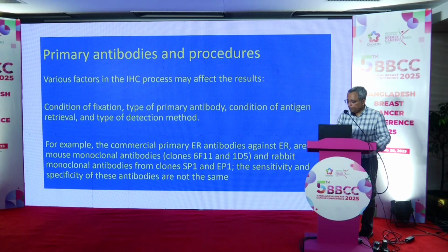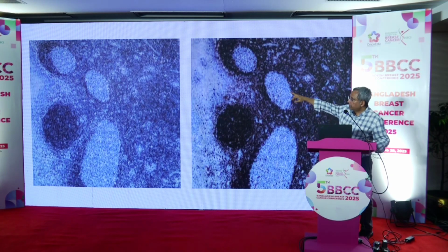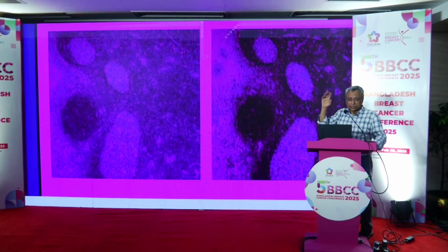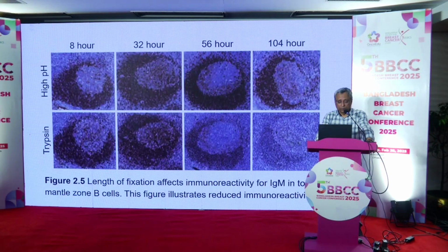So here, this is an example of using 2 different clones. You see the intensity is very different. That clone is a bit lighter. This is more dark. So this is what happens between clones.